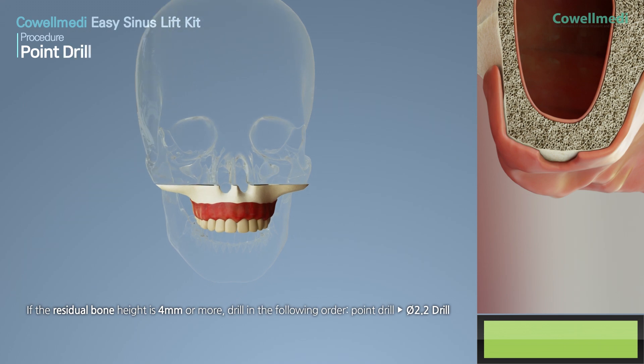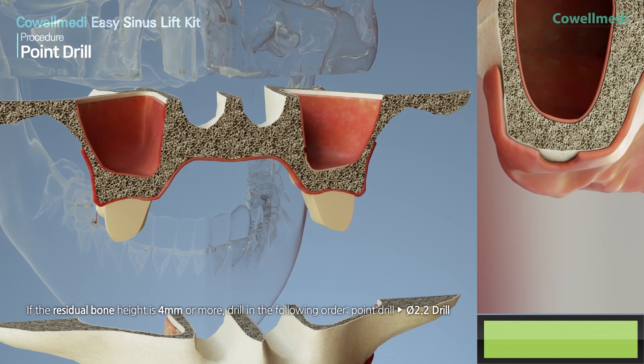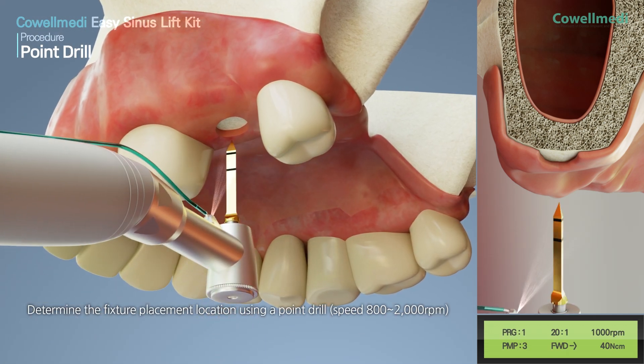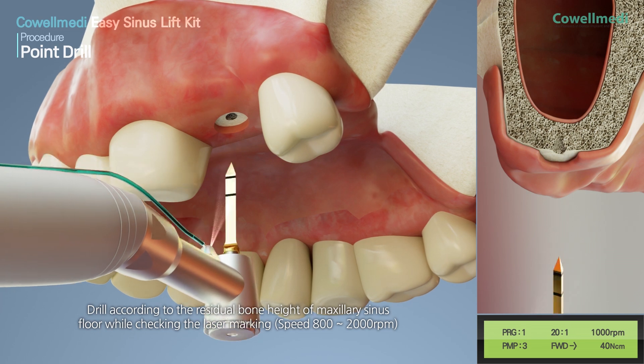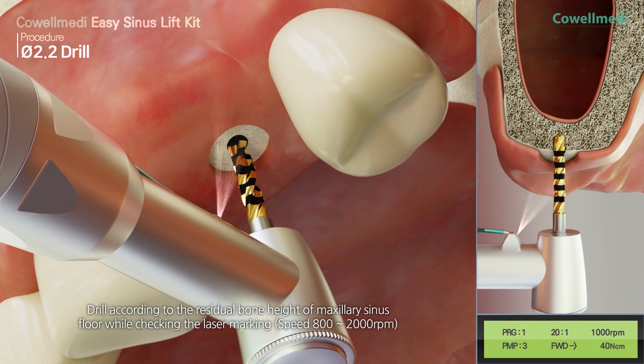If the residual bone height is 4 mm or more, use the point drill followed by the PI 2.2 drill. Determine the fixture placement location using the point drill, then drill according to the maxillary sinus floor residual bone height while checking the laser marking.